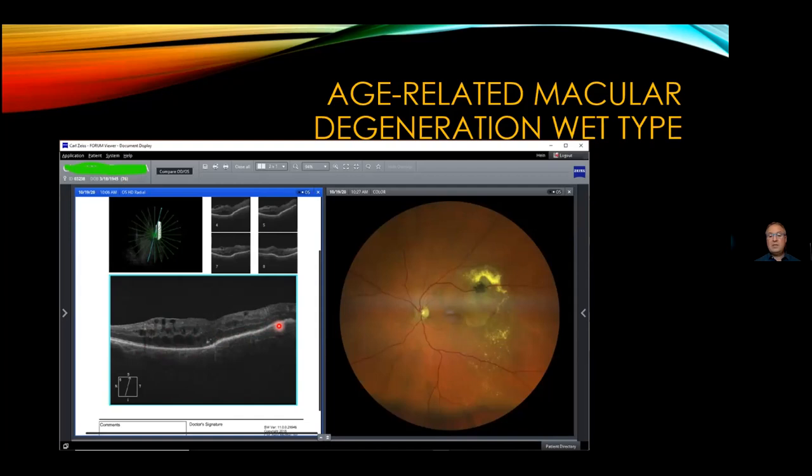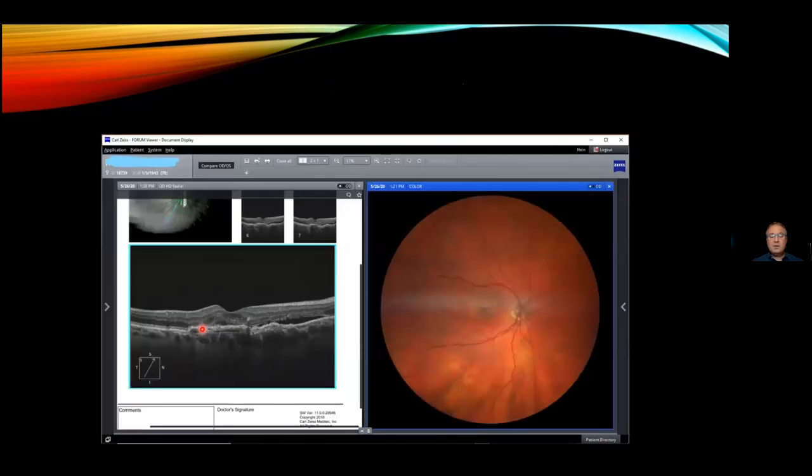This patient is treated with anti-VEGF injections, and what we're trying to do with that is to limit her scotoma, to try and make this scotoma as small as possible and try and get rid of as much fluid as we can. Unfortunately, we still have patients expecting that if we do 1 injection or 2 injections or 3 injections, that we're going to treat and we're going to cure them and they're going to have normal vision.